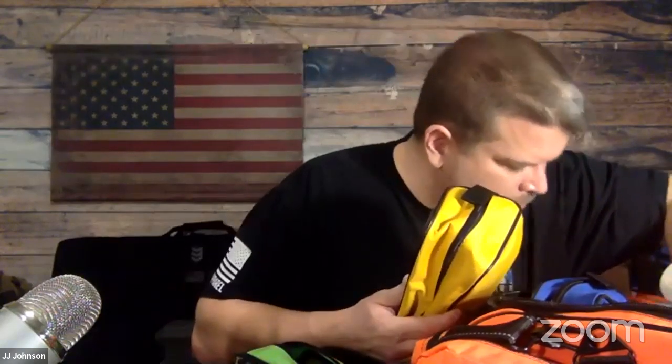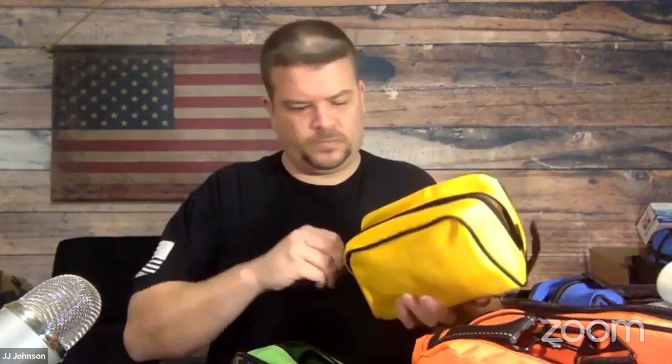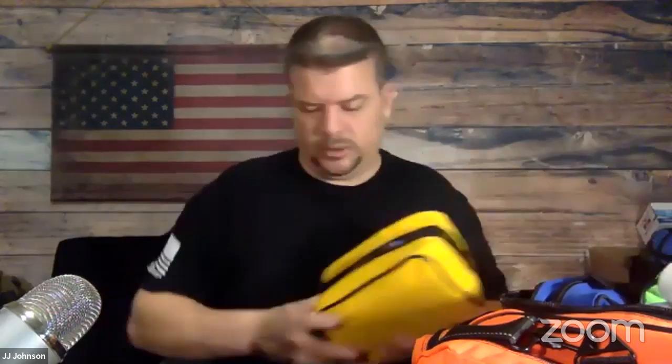Okay, so the yellow kit, and this is the last one. The only other thing I've got in here is a bunch of, I don't know if you can see these, big strong zip ties. And I figured those might be helpful in splinting up some stuff too, potentially. Okay, get this out of here. Go through and repack this once you guys are off camera.